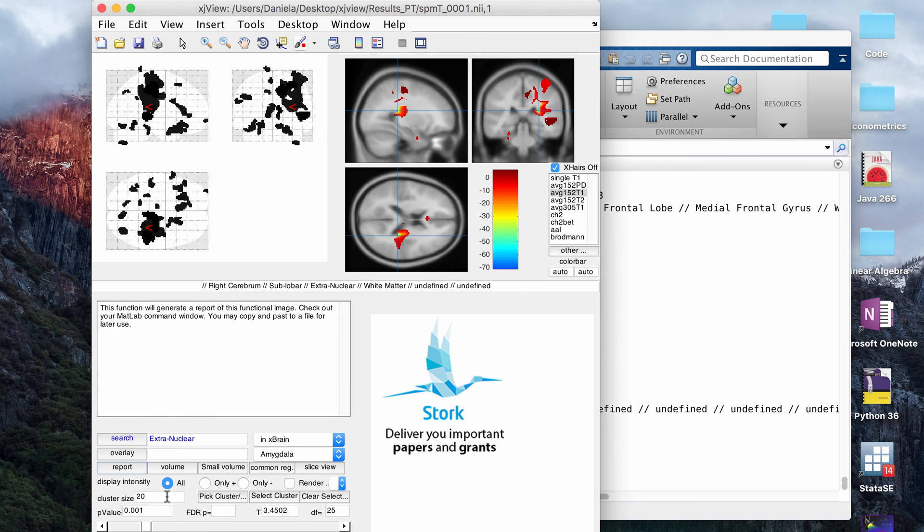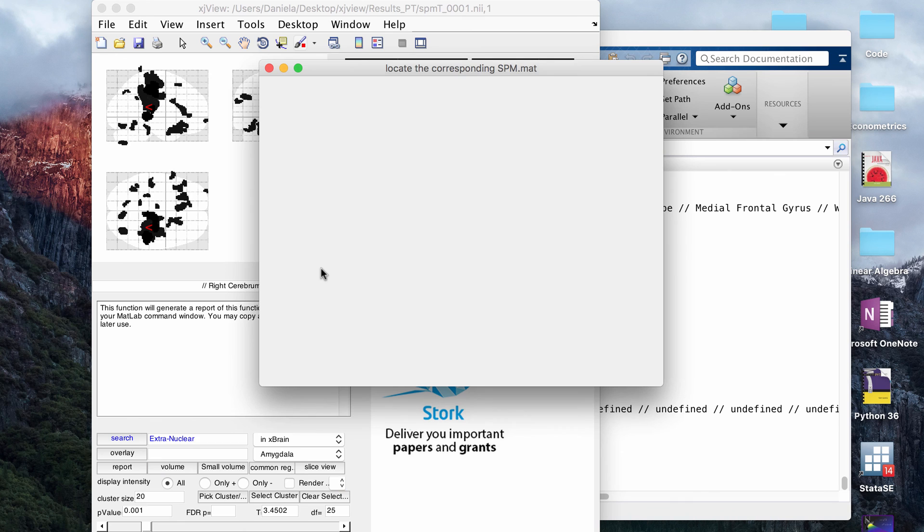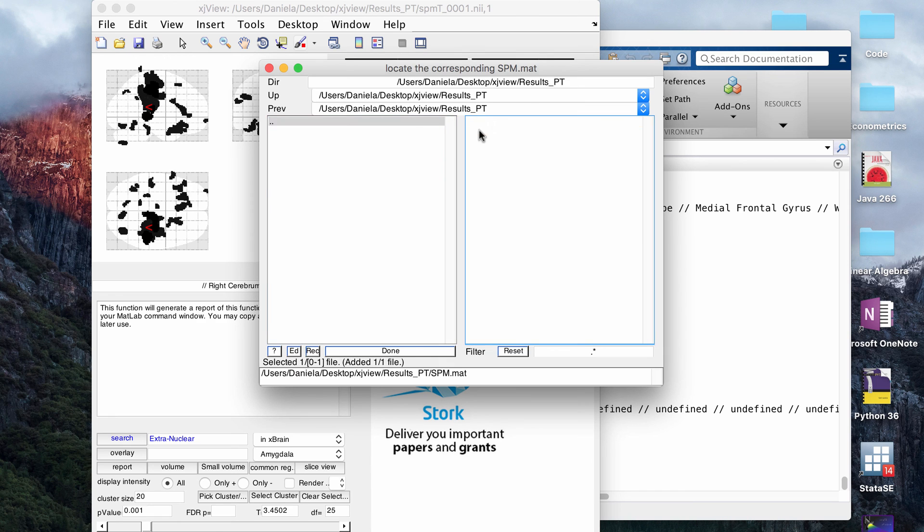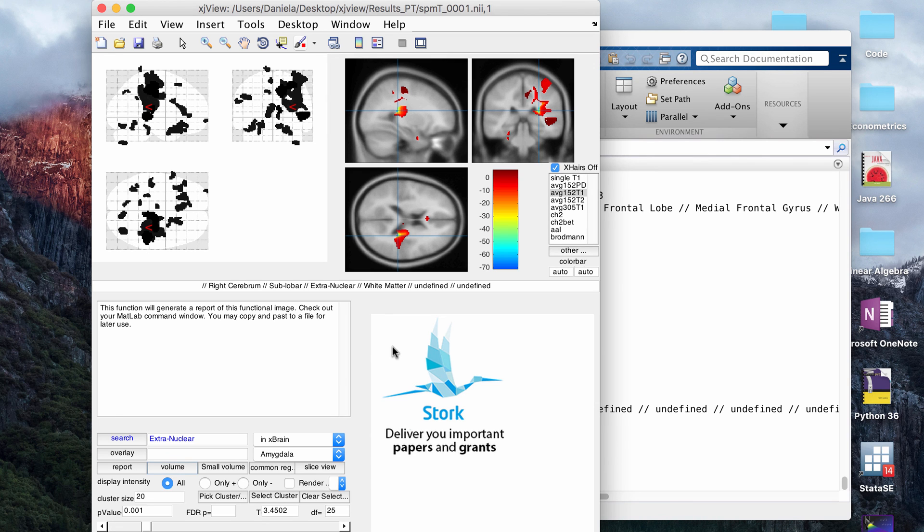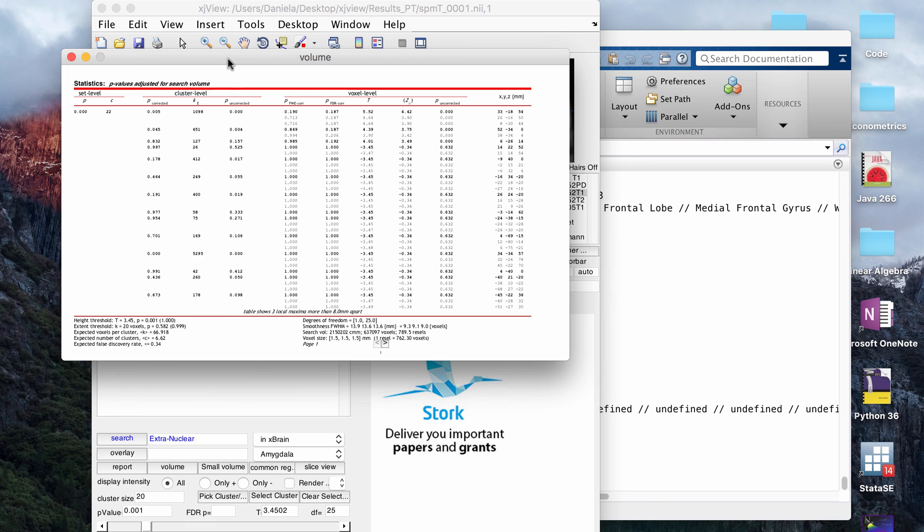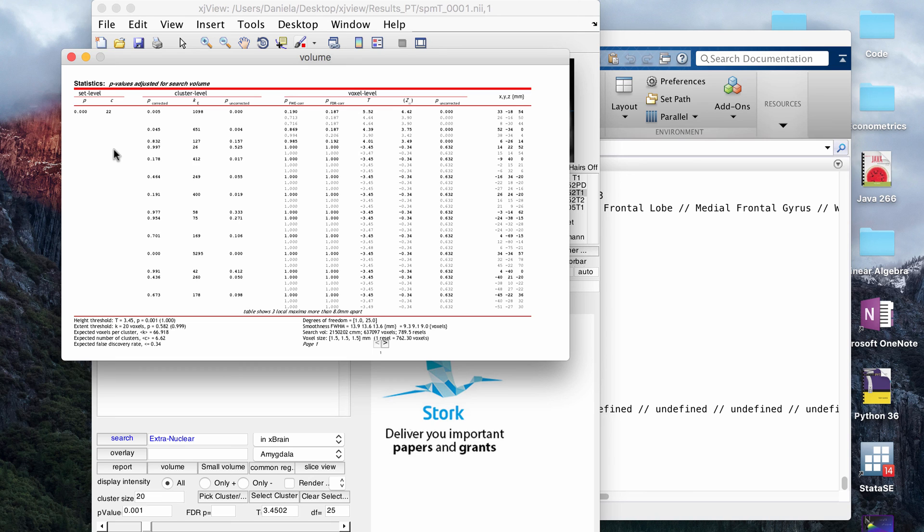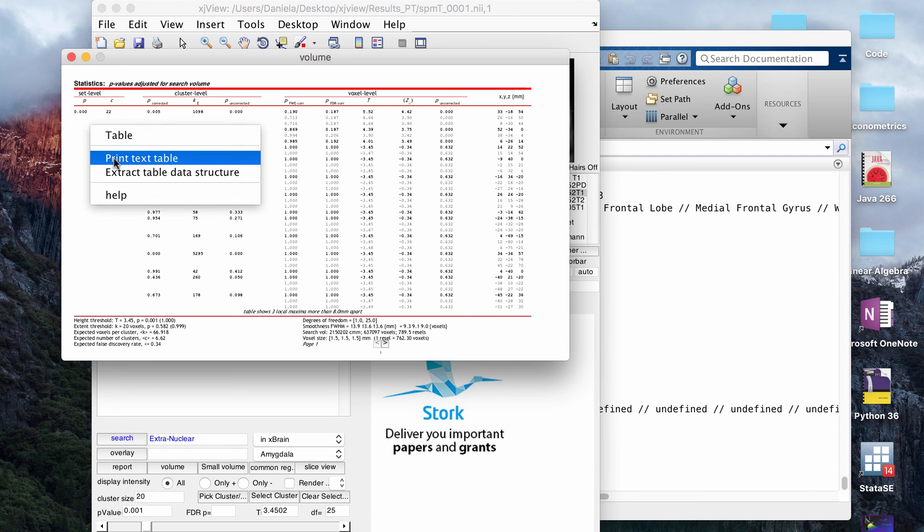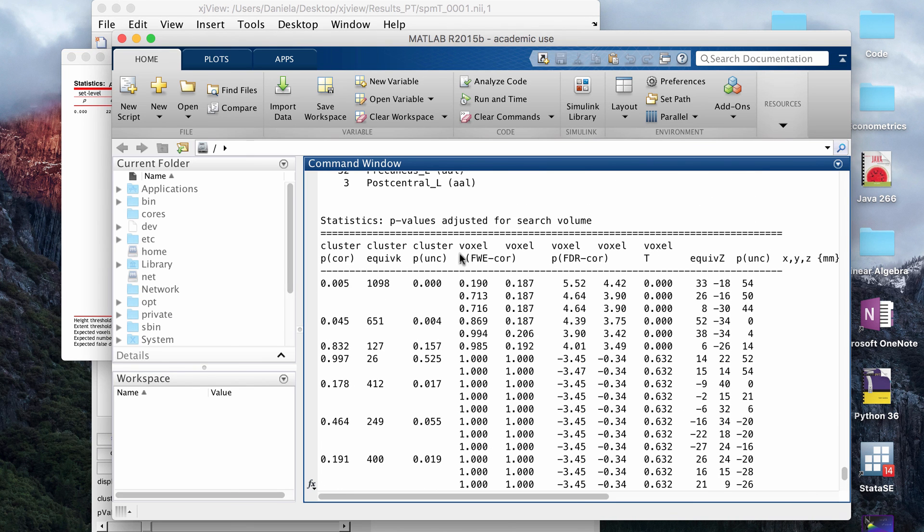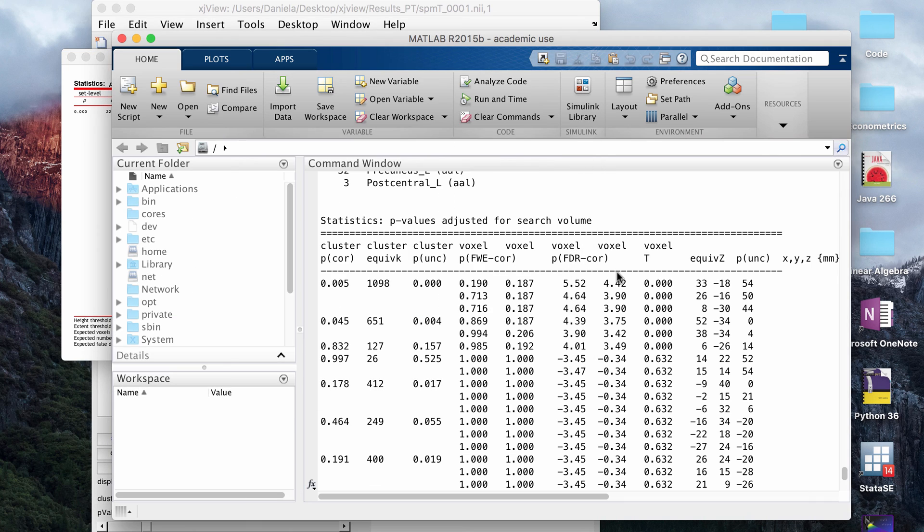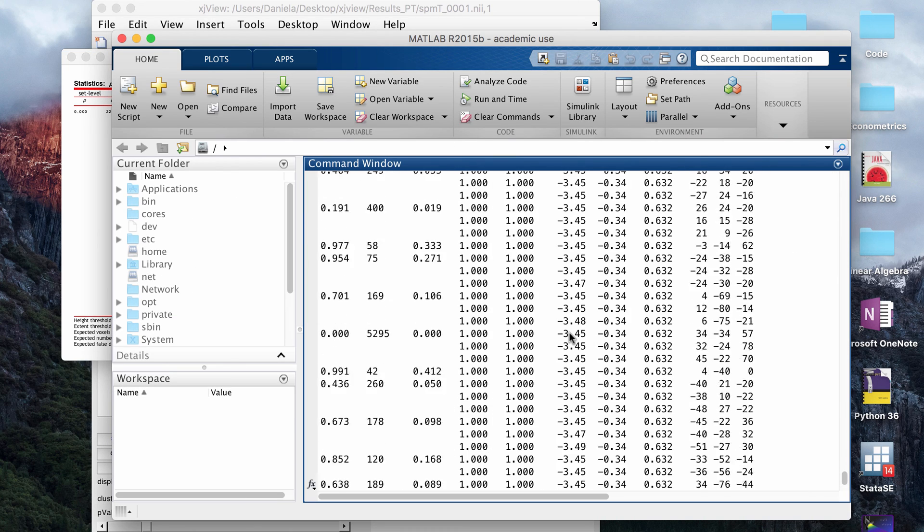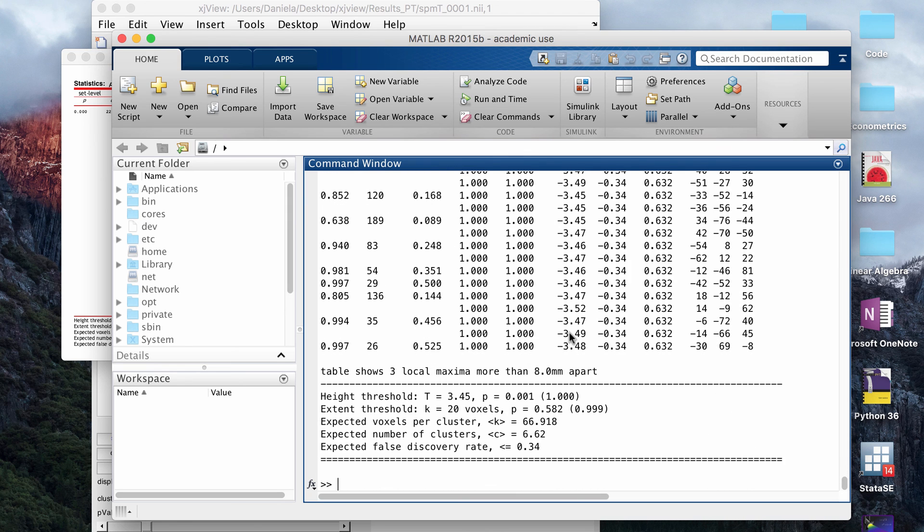Another thing that you can do, which you can get this through SPM, but it'll also show you from this XJ view window, is to get the statistics, which is really nice. If you click volume, then you're going to need... if you do a VBM, it's going to be the SPM.mat file. Let me just find that, and it shows up as the only option in the folder, and click done, and you can't really see it when it pops up. It doesn't let me make this any bigger, but you see the statistics for the set of all the clusters, the clusters here, and then the voxels here, and also gives you the locations of the clusters, which is really nice. So this gives you the p values for whatever you want, the clusters or the voxels or the whole set, and let me print this table to MATLAB. So this is really nice if you want to see, well, I see a cluster, but is it actually statistically significant? And if so, how much? So you can do statistics on the VBM.